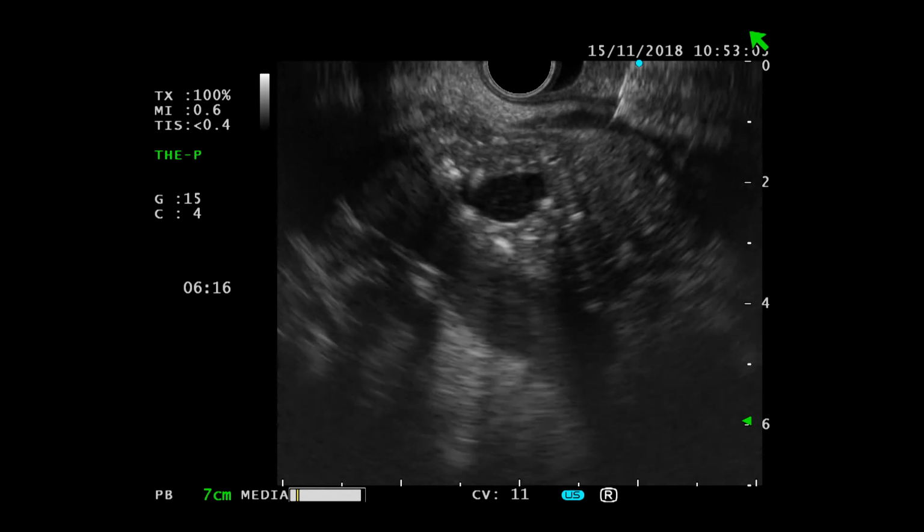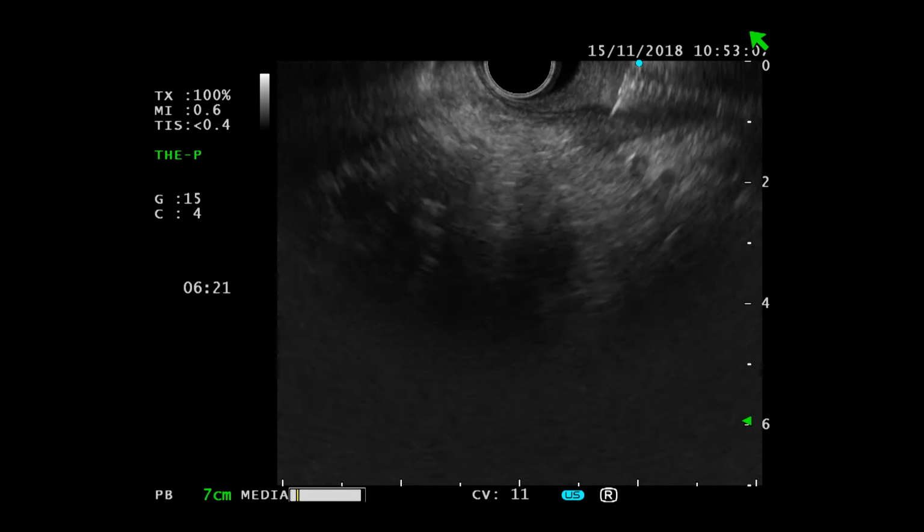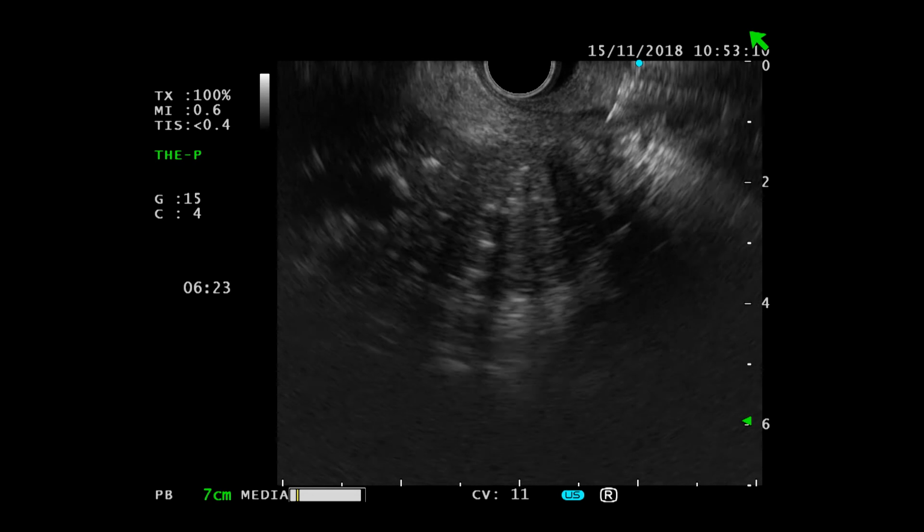Claudia, how do you process the sample when you say the 25 FNA needle is certified for biopsy too?